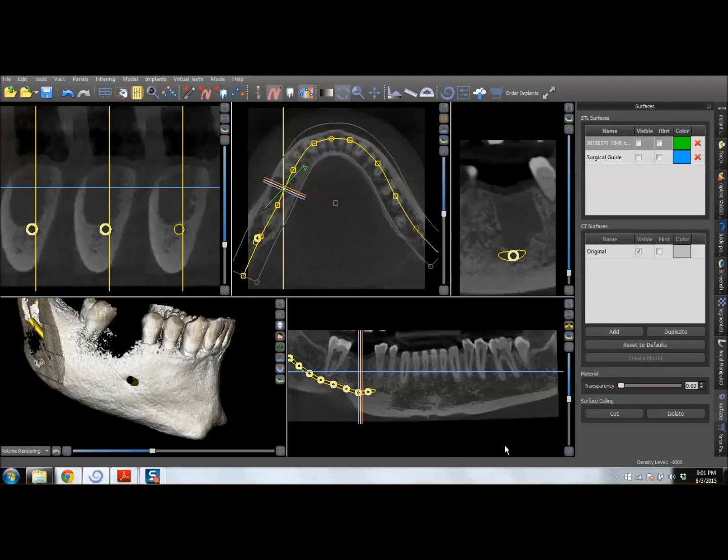Hi, this is Dr. Corey Glenn, and I'm going to give you just a quick run through of the software portion of this case that I'm about to demonstrate.